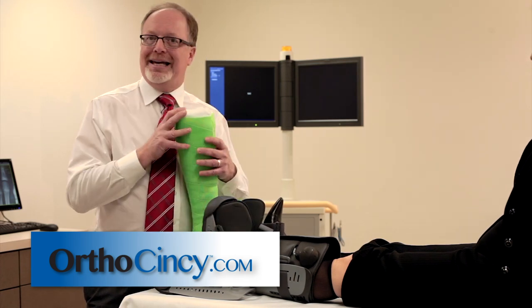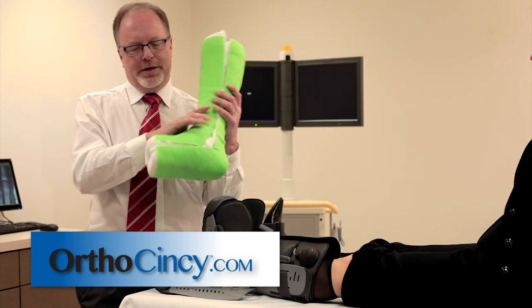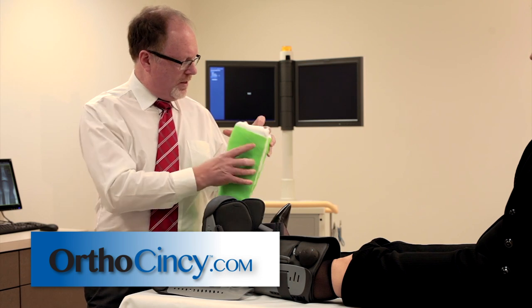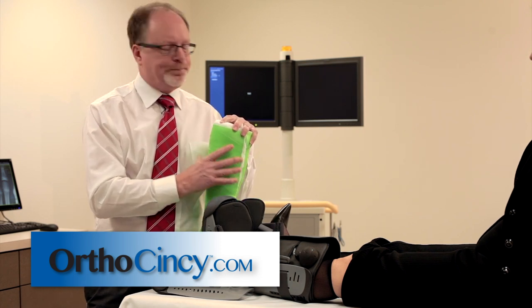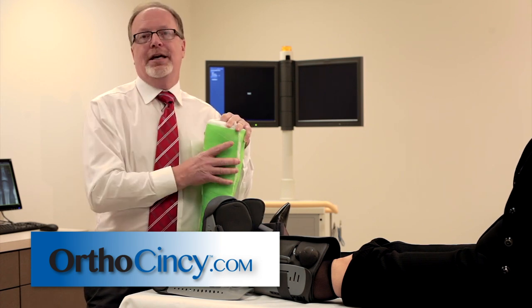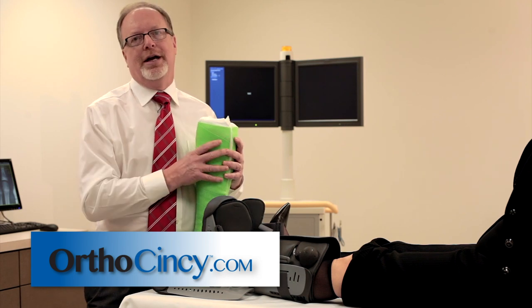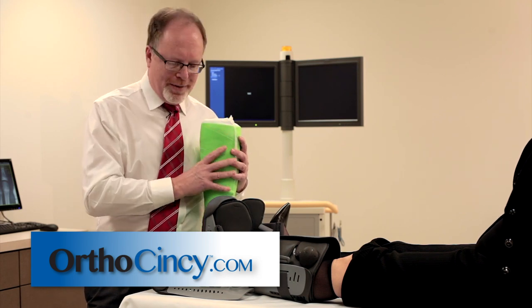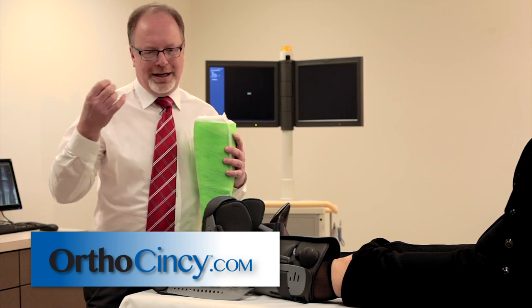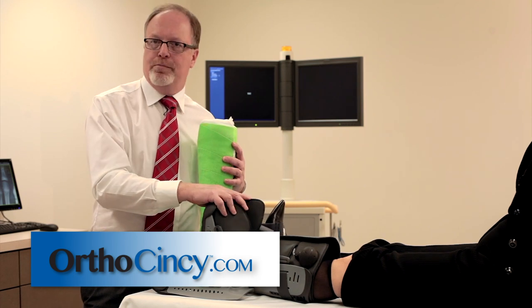The nice thing about a cast is that it's custom made. That's why we have one that's been cut off — this is directly from the patient. We can't use that for anybody else. It's properly padded, it's properly fit. The great thing about a cast is it will just sit and do its job of holding you still and letting you heal. The bad part about a cast is it never leaves. It's always there. You have to shower and keep it dry. You have to sleep in it. You have to live with this thing.